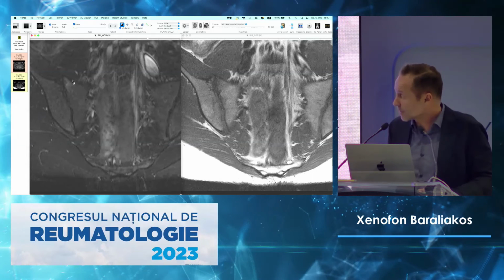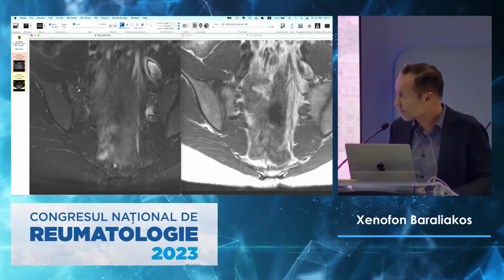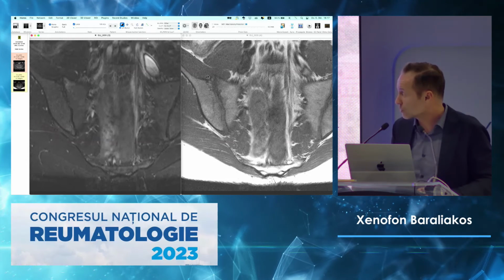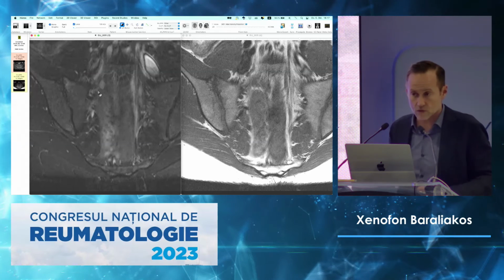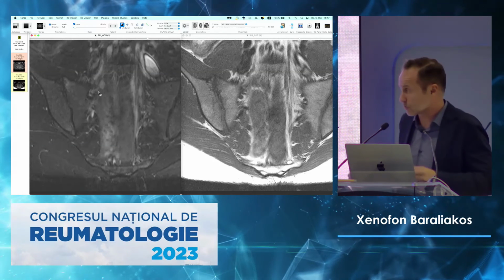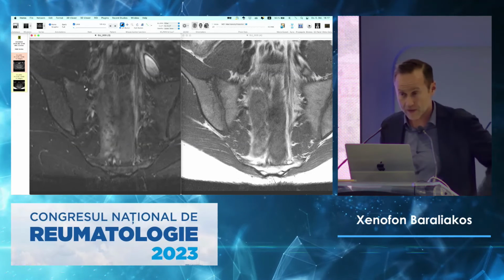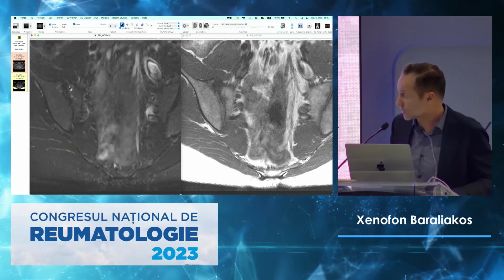You see that there is some edema around the capsular area that still shows some osteophytic formation. And that is looking also to the patient. That is a patient who is a hard worker, working outside, building the streets, having chronic back pain, around 45, but still that edema is more degenerative.